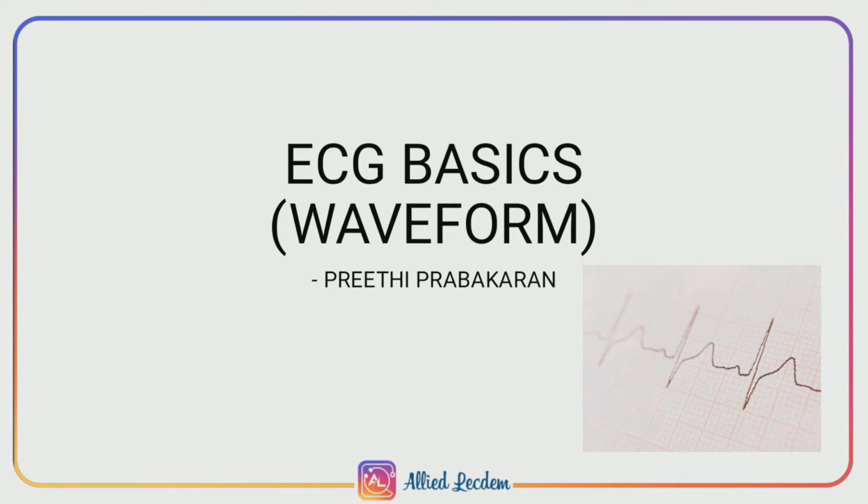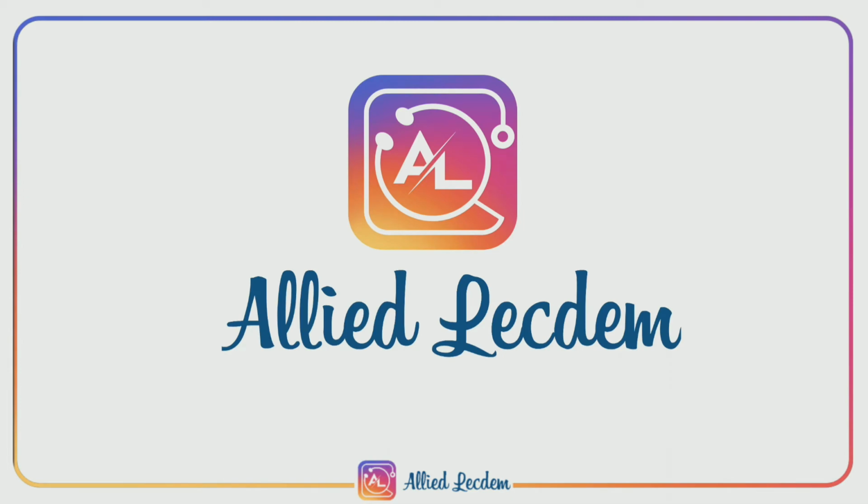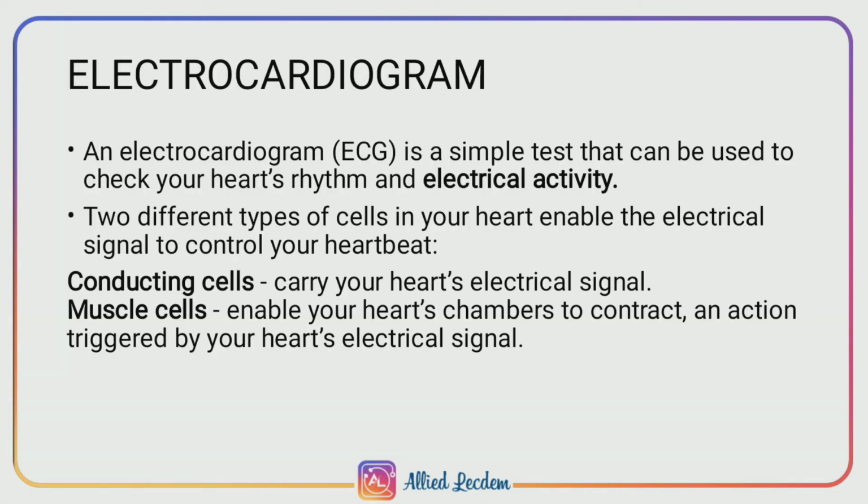Today's topic is about ECG basics, especially wave formation. Electrocardiogram. The term electrocardiogram can be split as electro, meaning electricity, cardio, meaning heart, and gram, meaning visualize. An electrocardiogram is a simple test that can be used to check your heart's rhythm and electrical activity.